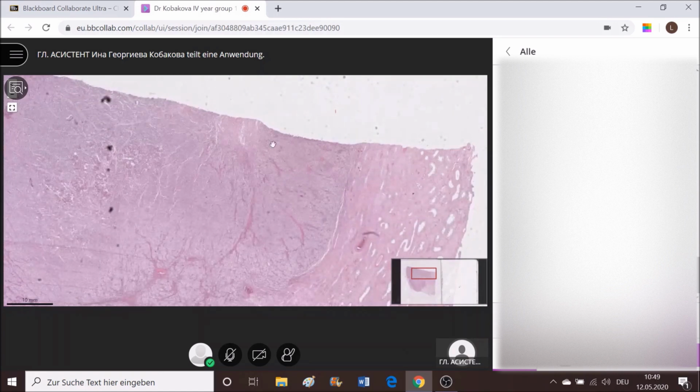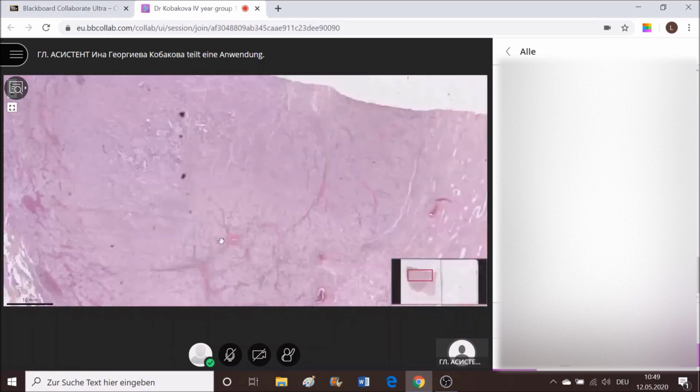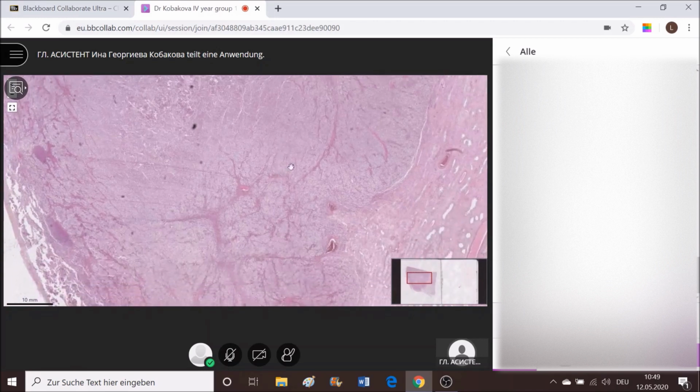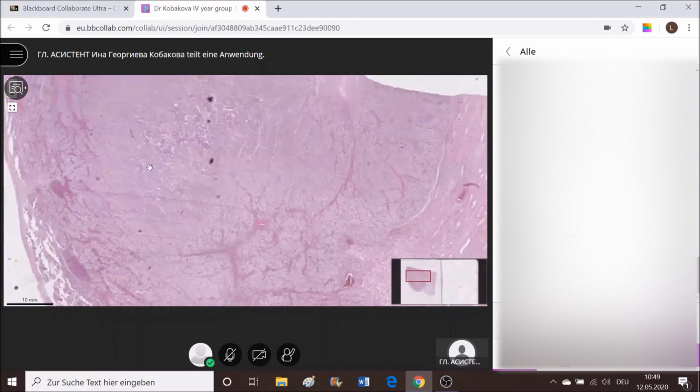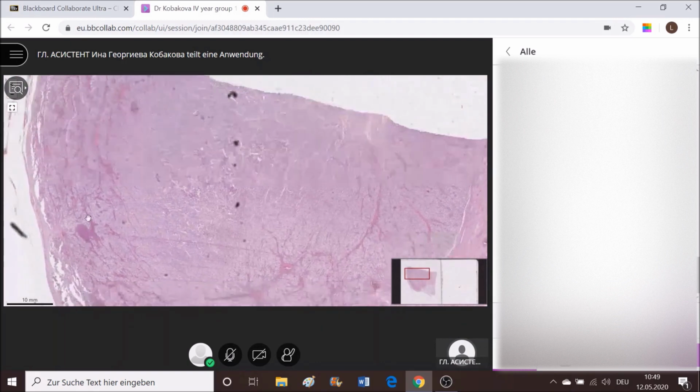So it's well-demarcated tumor made majorly by a monomorphous population of cells mixed with chronic inflammatory cells at the form of lymphocytes. Stroma is not much, vascular system is well observed, and necrotic fields often may be observed on certain places of the tumor.